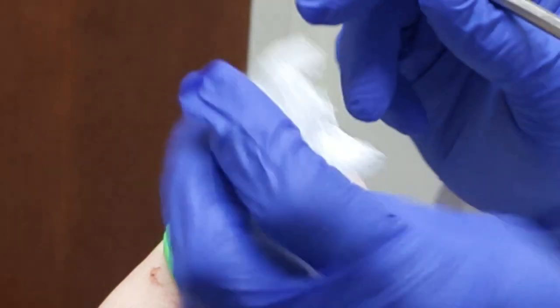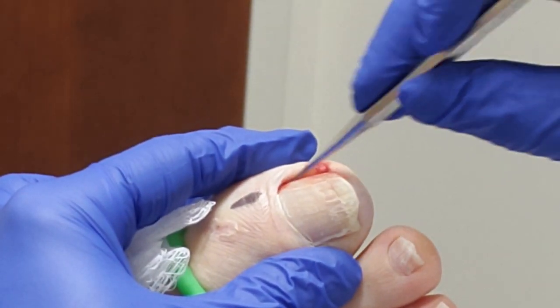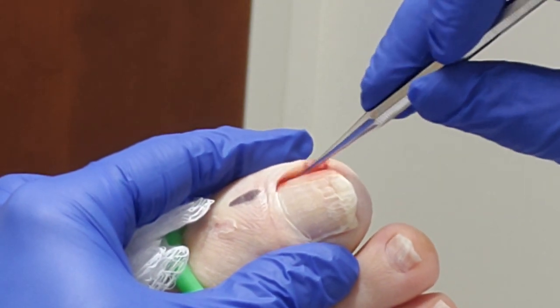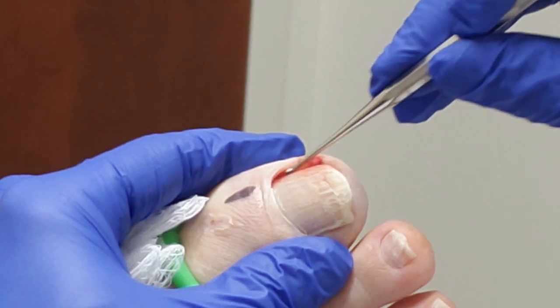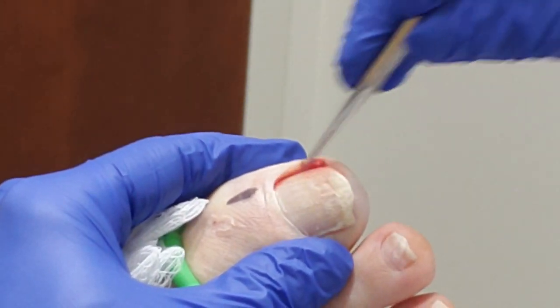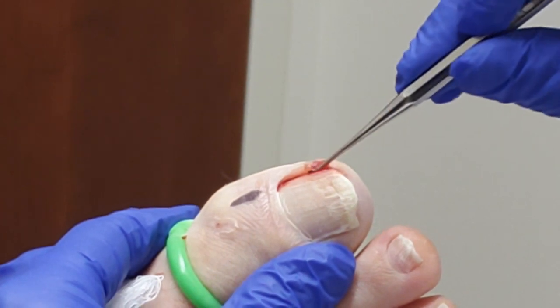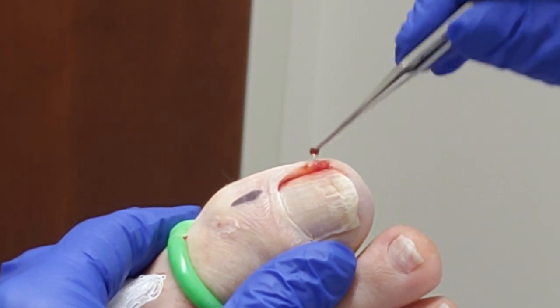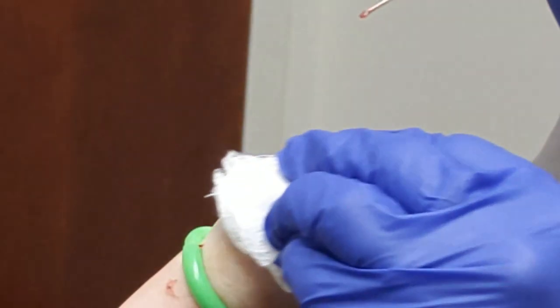Then I take a little curette, and you want to make sure that there's no pieces of nail left inside. That's what I feel for. So you want to feel the side of the nail and all inside there — you have to take out all the nail. You can just trim a little curve to make that go away, but that's not really going to resolve things. It's better to take out a bigger piece of nail.